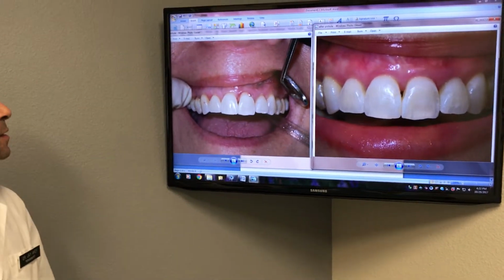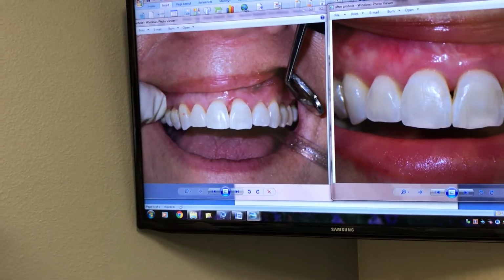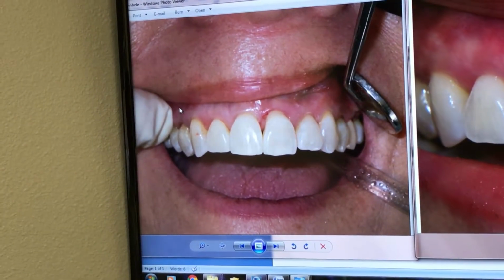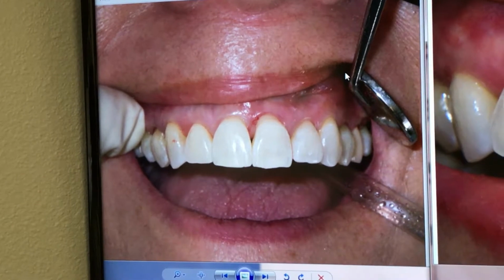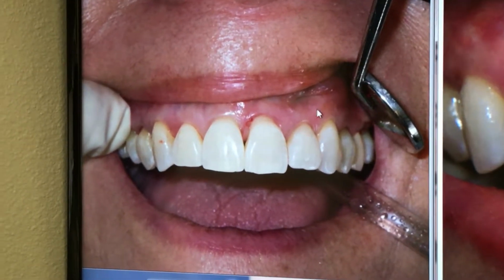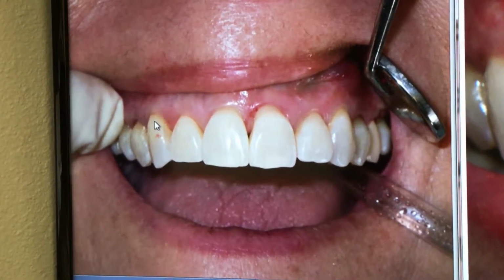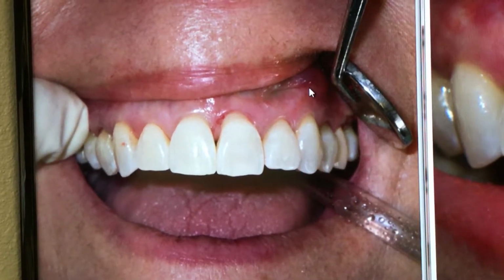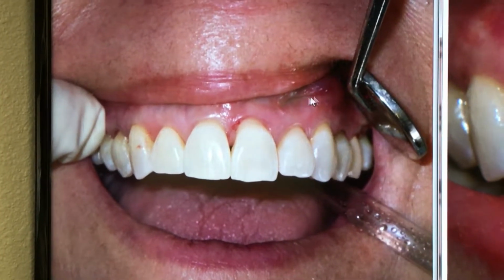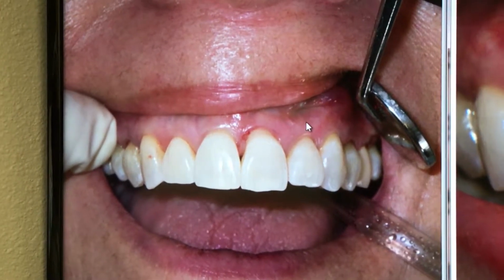You see here, there was recession here, and here, and here. So we did what we did. We put a hole right there. We put a hole right there, and lift up this gum around these teeth without making any incisions, and that's the key. Now the patient swells up a little bit on the lip the next day, and that's about it. And after that, they're pretty normal. They don't even know what we did the next day.